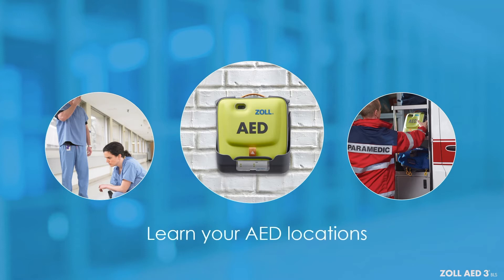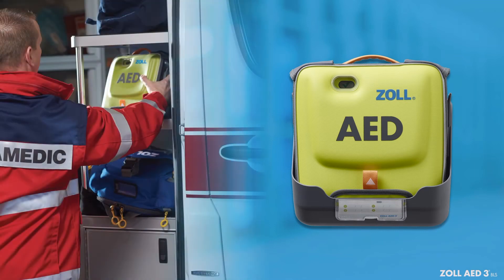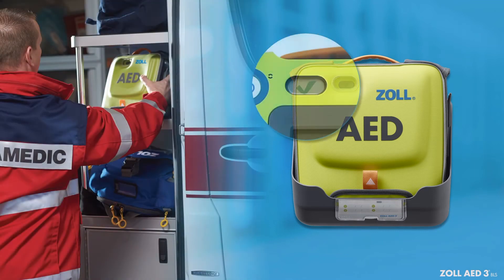Also, learn the locations where your devices are kept so that you are ready to grab one quickly. As you approach your Zoll AED-3BLS, look for the green check symbol in the status indicator window. A green check means that the device has passed its periodic self-test and is ready for use.